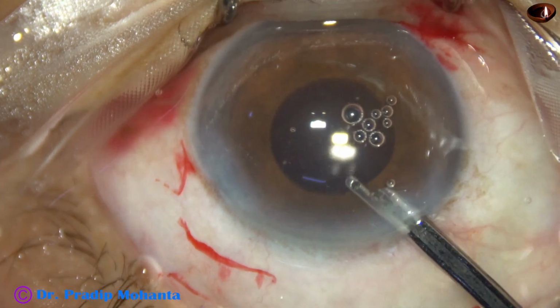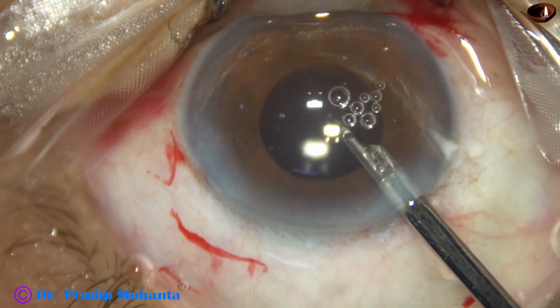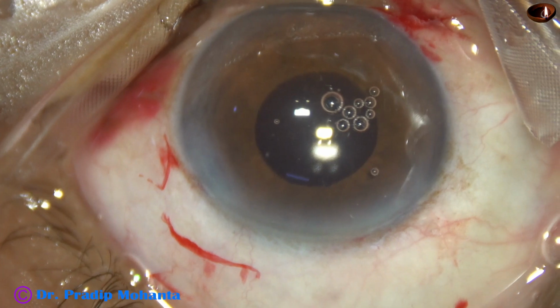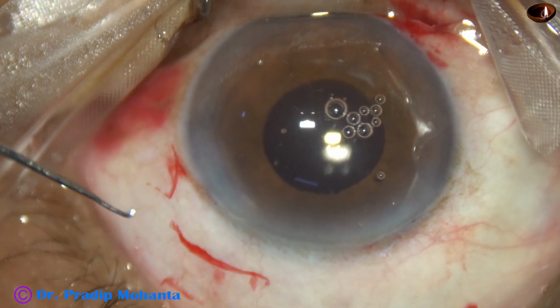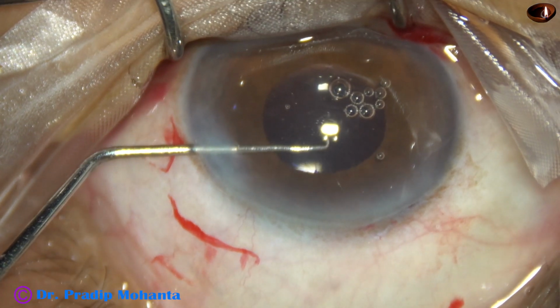And I can see a strand which is coming to the main wound. To confirm it, I take a Sinskey hook, go through the side port, and I find that it is there.